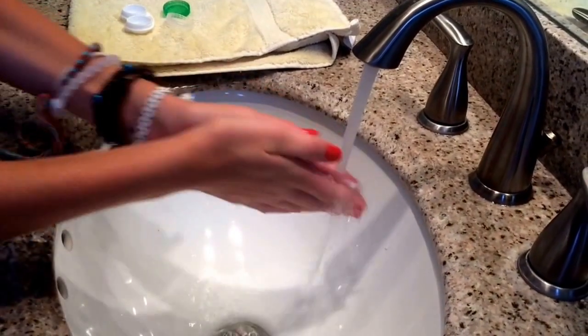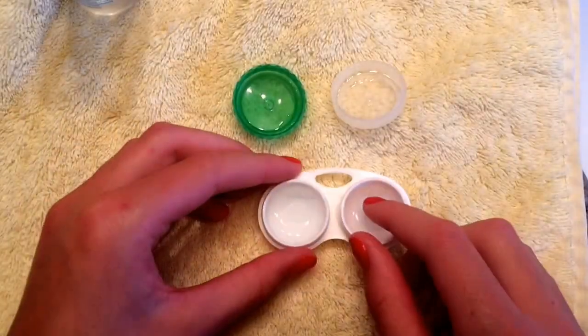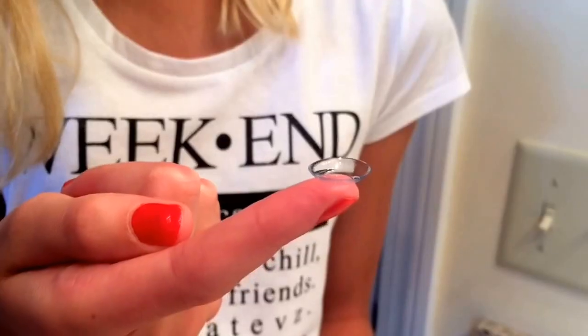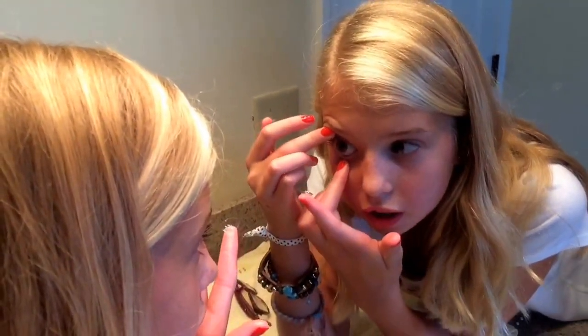Before you put your contacts in, make sure your hands are really clean to avoid bacteria getting into the eye. Scoop the contact out of the case, making sure it's on the pad of your finger. Lift your eyelids up so it's easier to put your contact in.